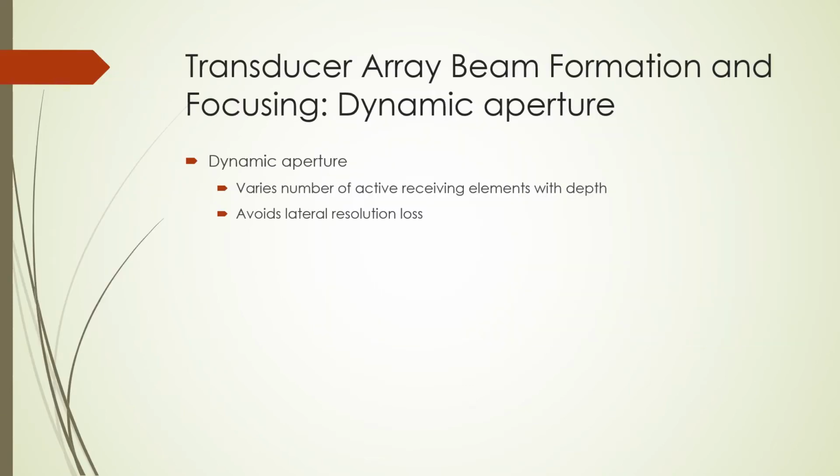Transducer arrays employ the technique of a dynamic aperture, in which the diameter of the sensitive region of the array is expanded as signals are received from greater depths. This technique maintains a constant lateral resolution with depth.